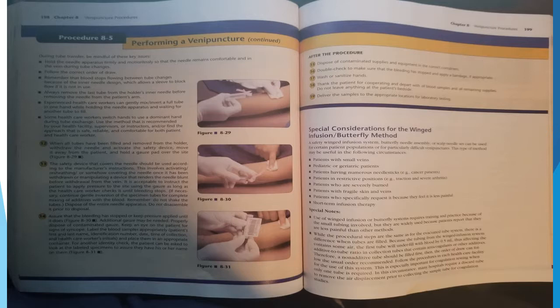In collection tubes that contain anticoagulants or other additives, therefore, a non-additive tube should be filled first. Then the order of draw can follow the usual order recommended. Follow the procedures in each healthcare facility for the use of this system. This is especially important for coagulation testing when only one tube is required. In this circumstance, many hospitals require a discard tube to remove the air displacement prior to collecting the sample tube for coagulation studies.